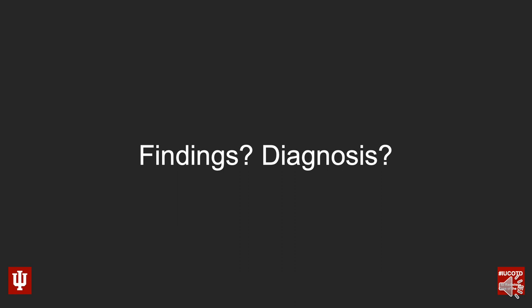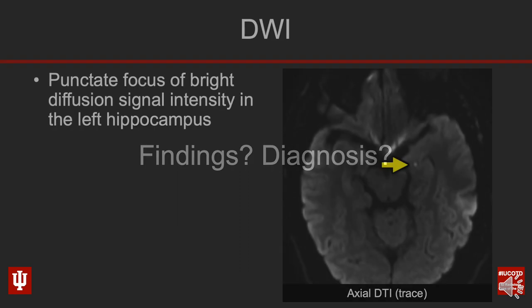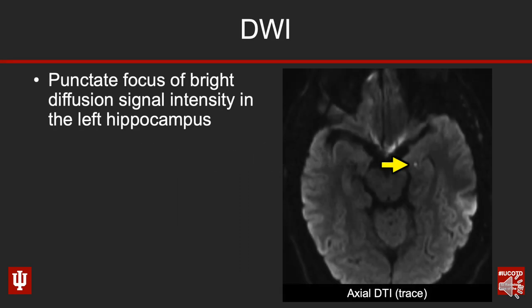Okay, so what are the findings and what's the diagnosis? Let's start with our imaging. First up, we have our axial diffusion weighted imaging, and you'll see that we have a punctate focus of bright diffusion signal intensity that is centered in the left hippocampus, as denoted here by the yellow arrow.